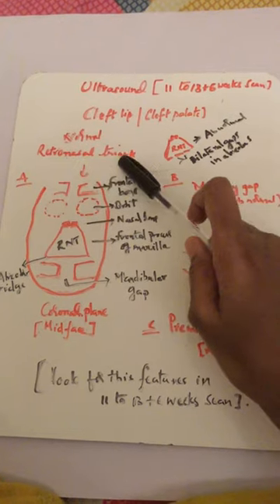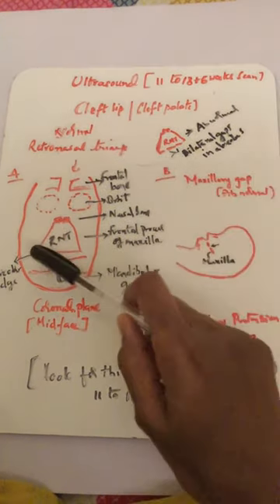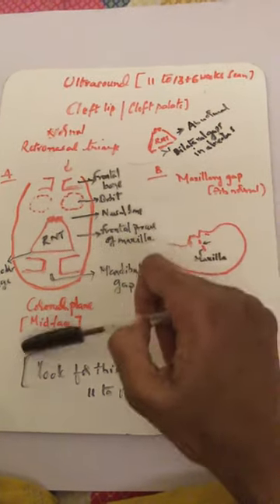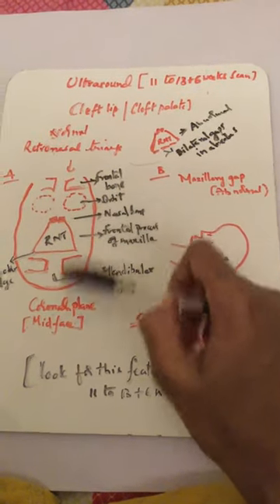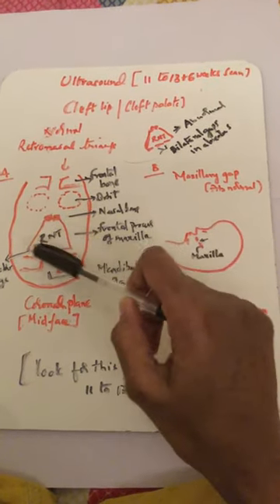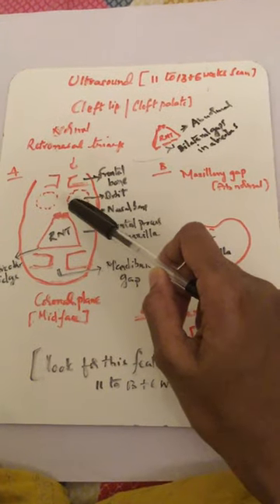One is the normal retronasal triangle. This is a coronal plane midface: this is the frontal bone, this is the orbit, this is the mandible with the mandibular gap. This is the retronasal triangle.